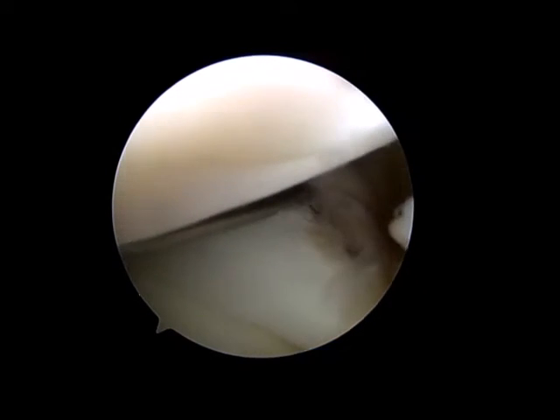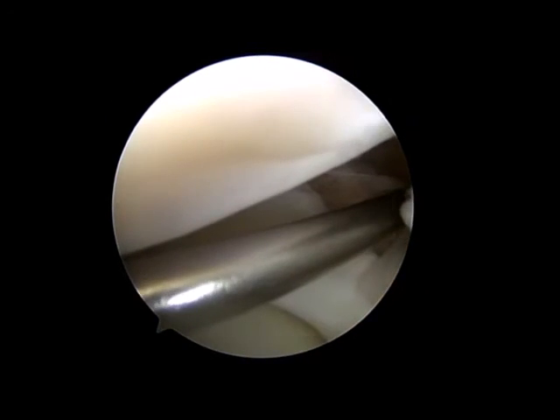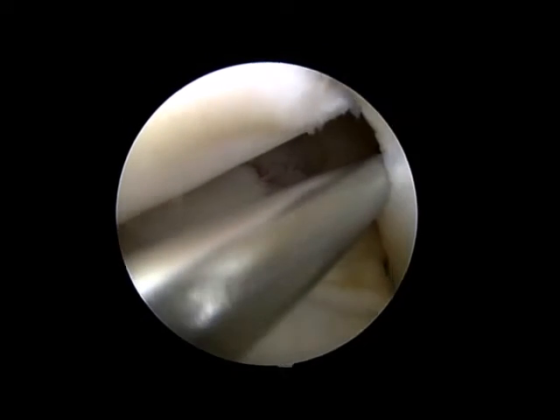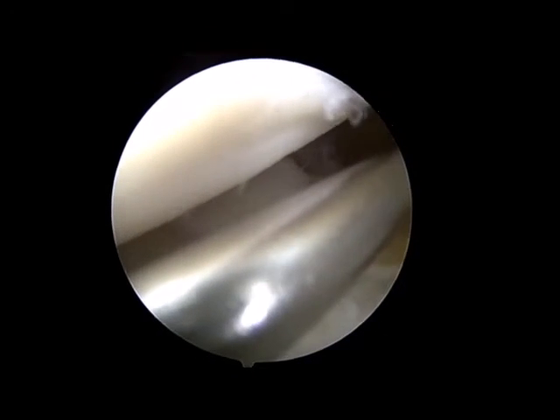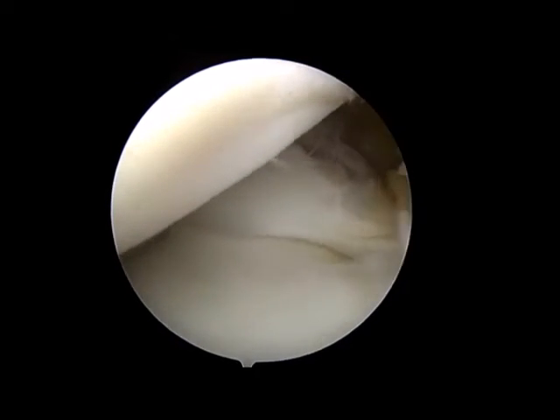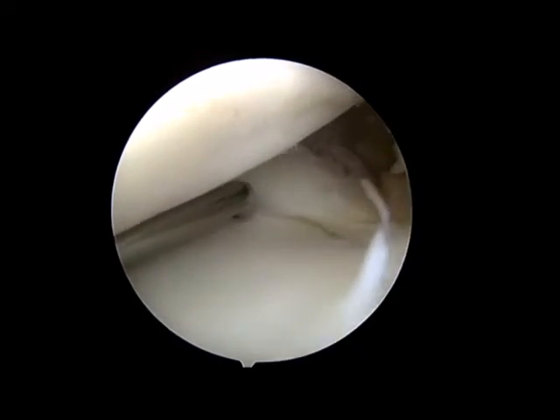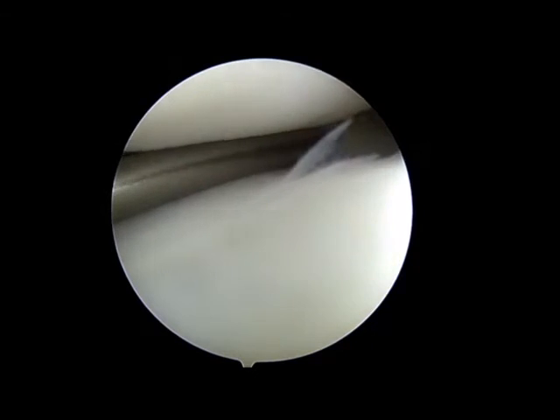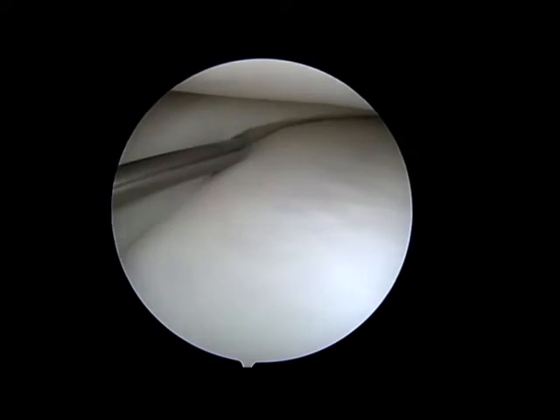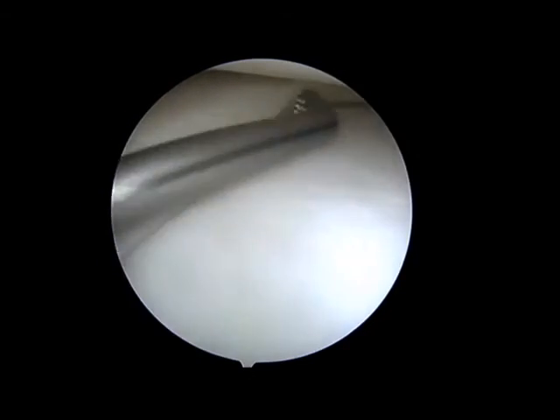Step one of the repair is to generate fresh bleeding within the tear gap. This is done to enhance the body's healing potential. A rough-ended rasp is used to abrade or roughen the meniscus tear edges.